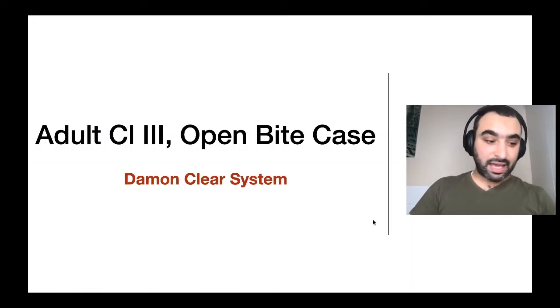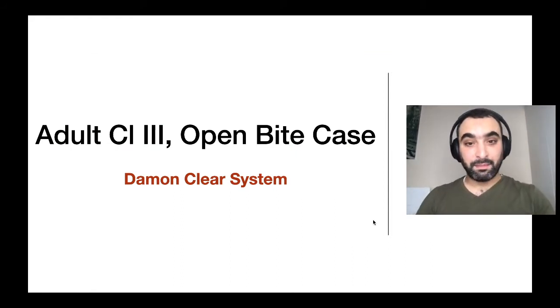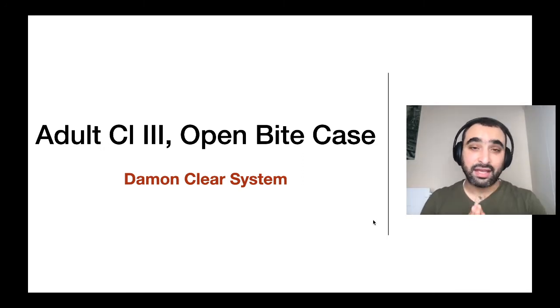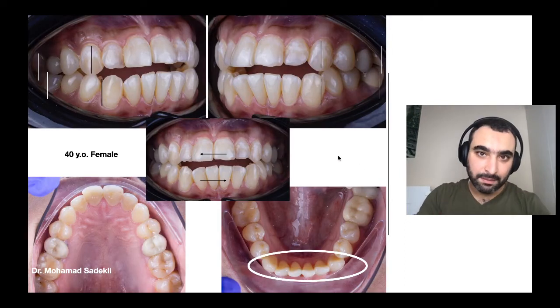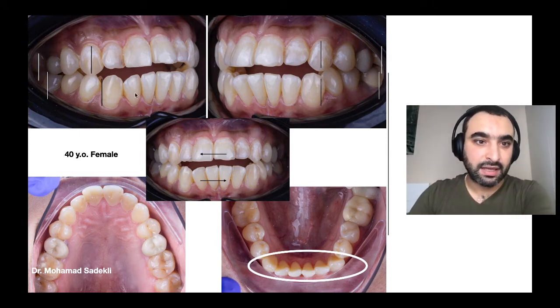Okay, the case is an adult, class 3, and open bite case. And the special thing with this one is that I used the Damon Clear 2 system for this case. Let's go for the before treatment photo. Let's see together here. It's an open bite, as I told you, a 40 years old female.